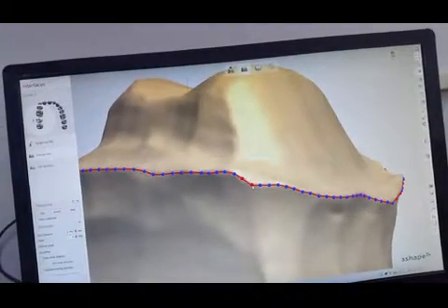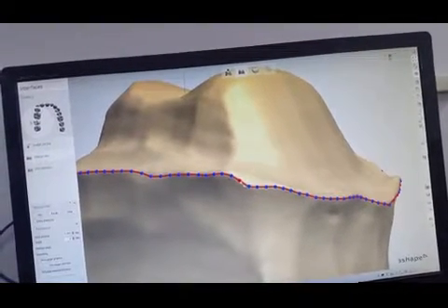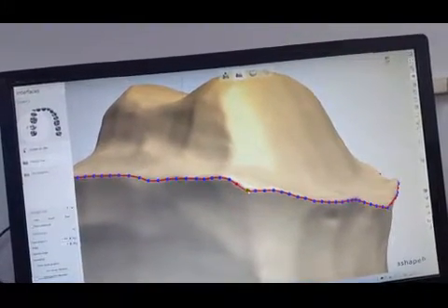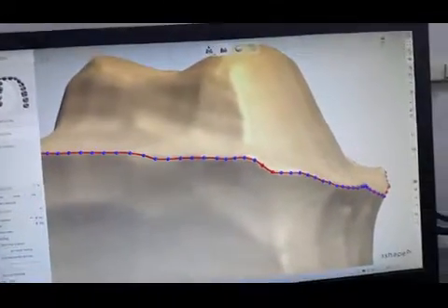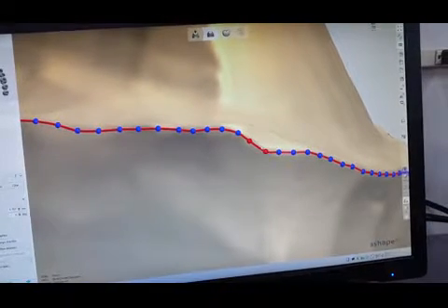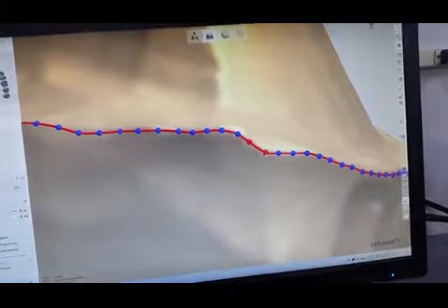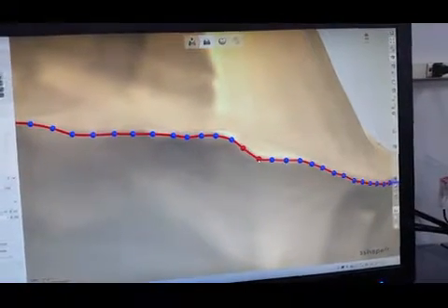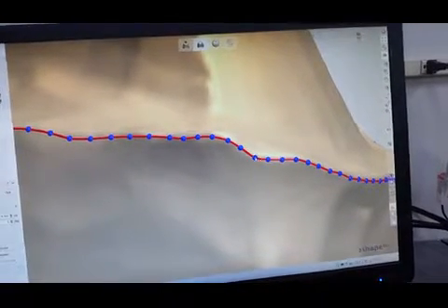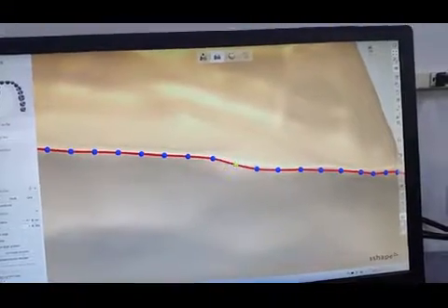with these two dots right here, you know, I would like to keep it right here for the line. And I'm not sure how well you can see the line in the picture, but I can see it right here, and I'd like to have my dots just below that. And it's turning red. In this particular case, that doesn't mean it's a bad thing. I could lift it up and keep it blue, or I can put it where I like to, and if it turns red, then that's fine.